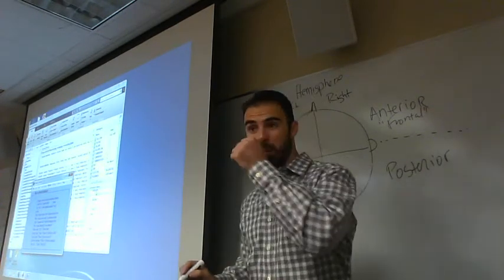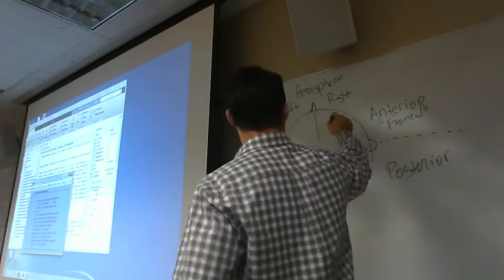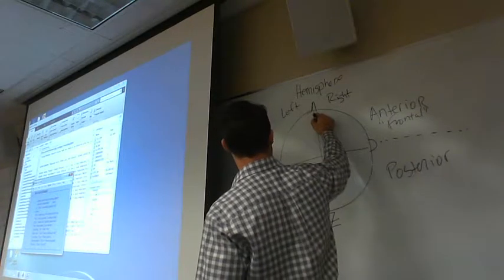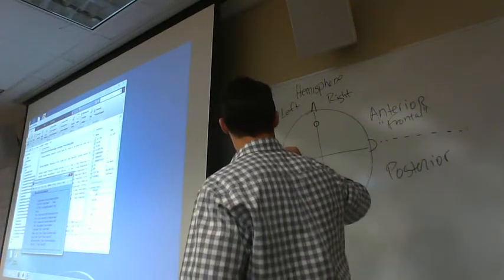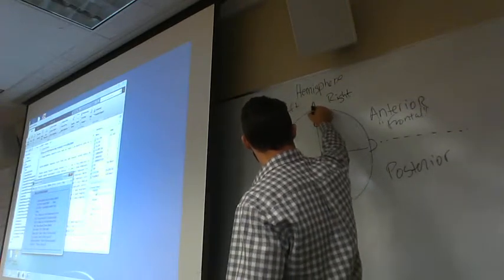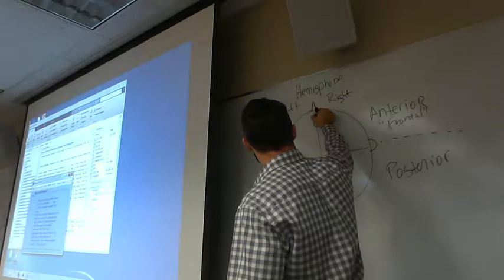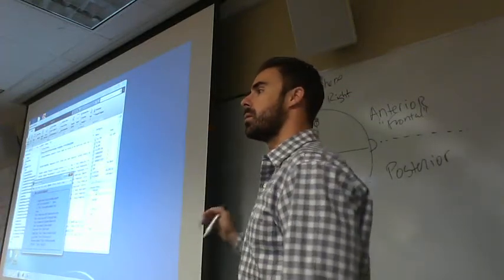Now we're going to use different coordinates here. So if you have, let's say, a site in the frontal cortex or the frontal scalp site, that might be called FZ, frontal, right on the center line.